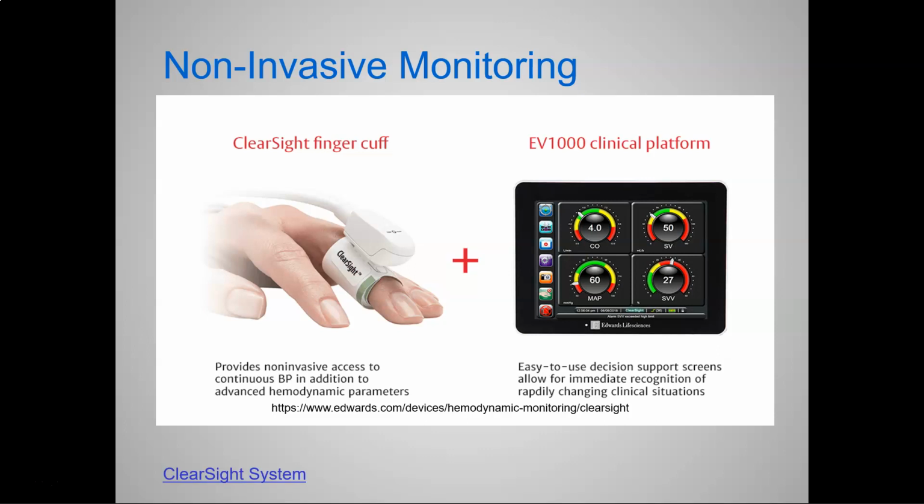But really, it looks like an SpO2 monitor. We tack it onto their finger, and it can actually calculate certain values. And not all. I can't get a wedge pressure here. But I can get cardiac output index, stroke volume assessments, systemic vascular values. I can get MAP. I can get all sorts of stuff based off this. And then if you put it in conjunction with, say, a central line, you can get even more values. But most of that is actually calculated through formulas in the machine. Obviously, I cannot get a dead-on to the milliliter calculation on my cardiac output, but I can get some pretty accurate estimations based on the values this machine assesses.